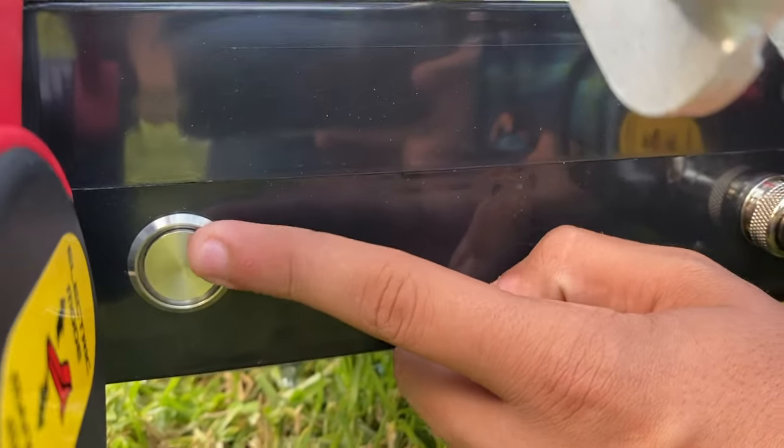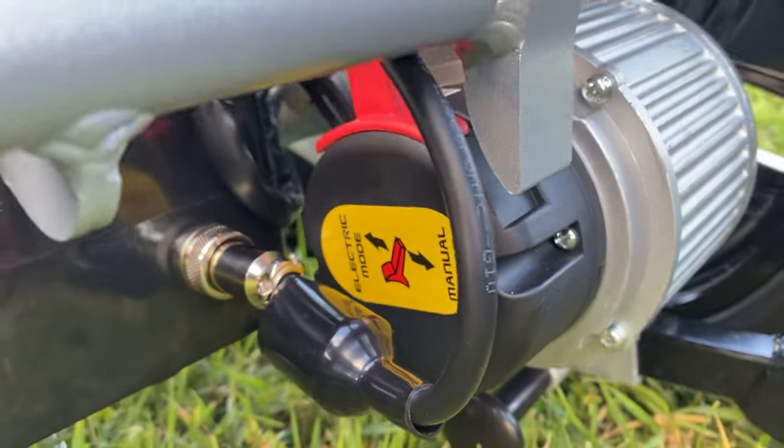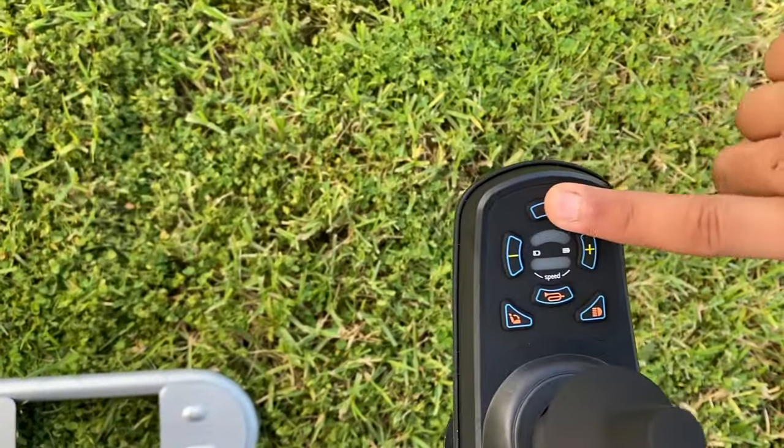Press the power button and make sure your wheelchair is in electrical mode. From the lever — this is manual mode, this is electric mode. Push the lever forward for electric, then go to your joystick and press the power button.